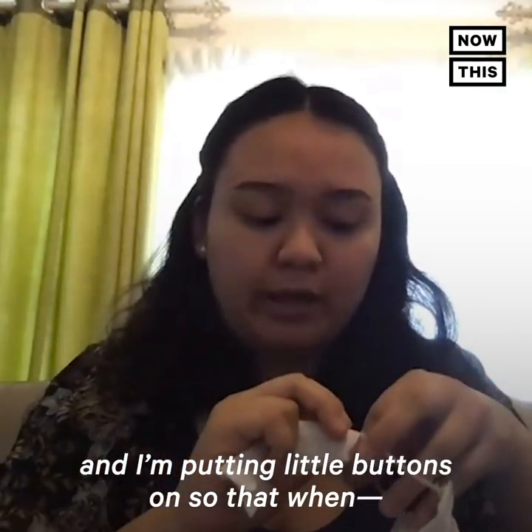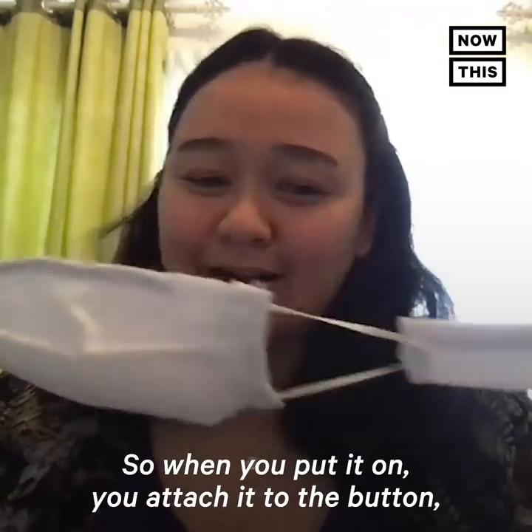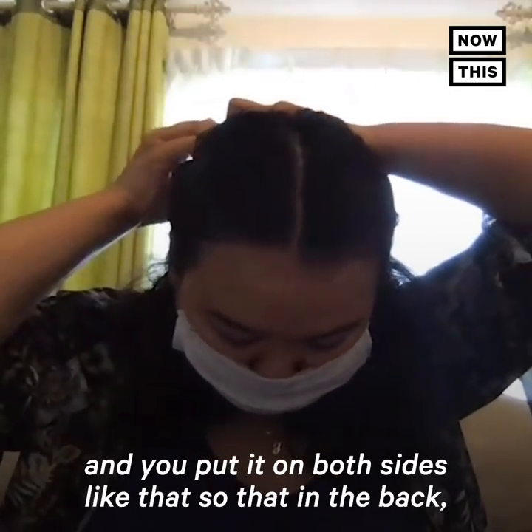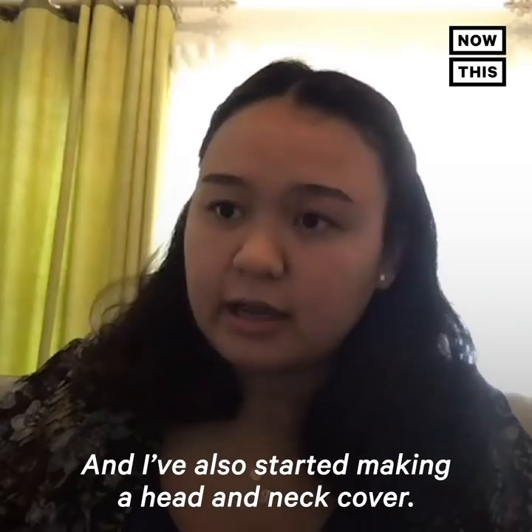I'm calling them mask straps — they're just a little piece of fabric with buttons on them. When you're having to wear a mask all day, you don't have to keep it on your ears. You attach it to the button on both sides so that in the back you have less strain on your ears.